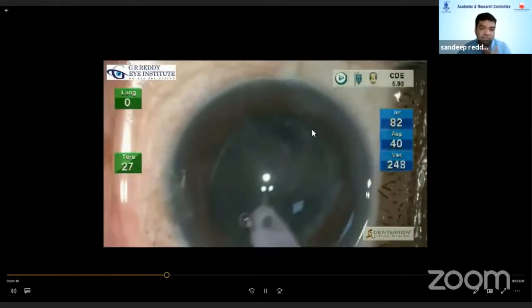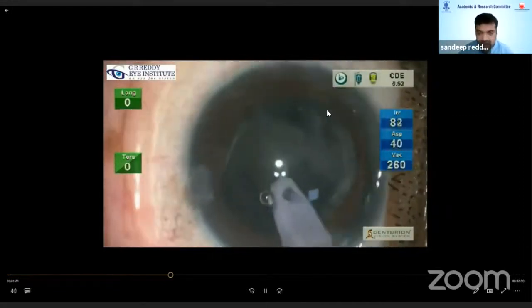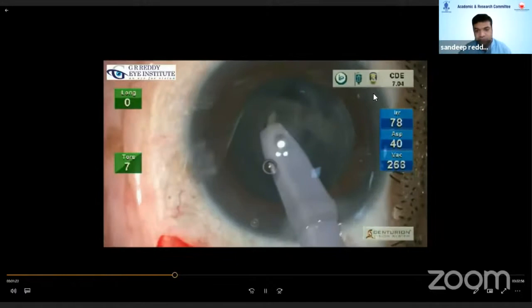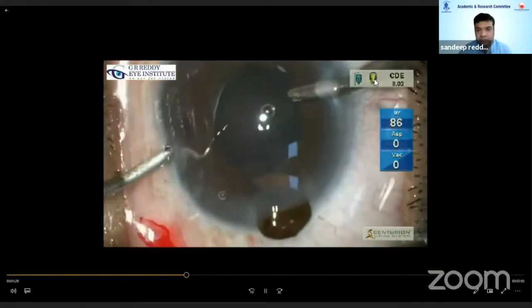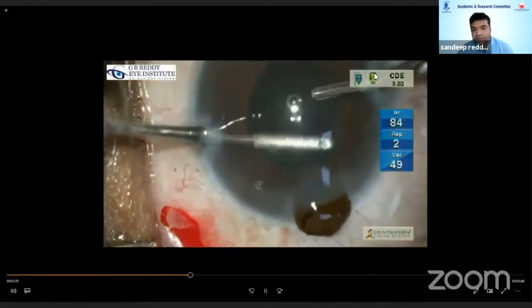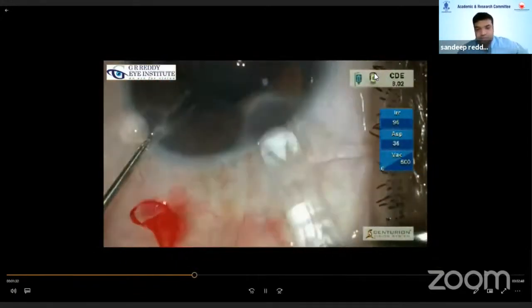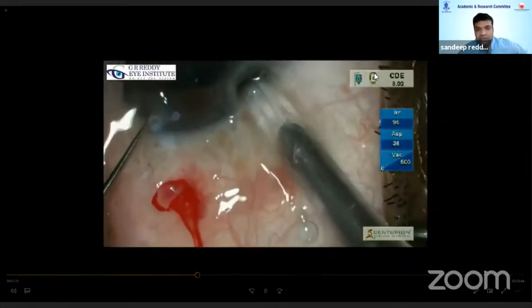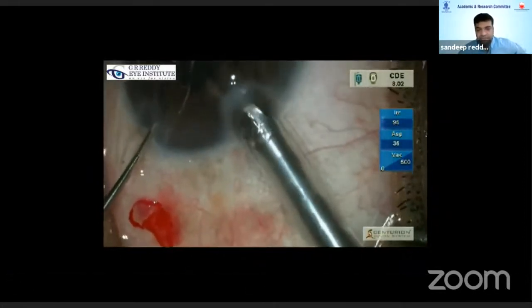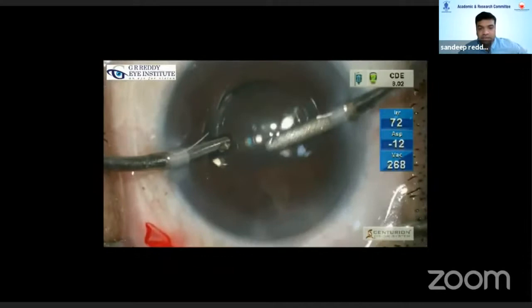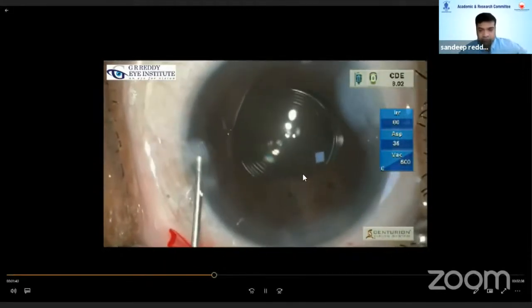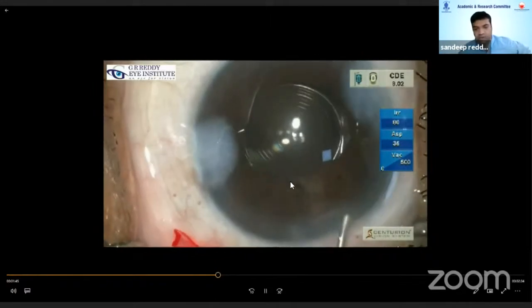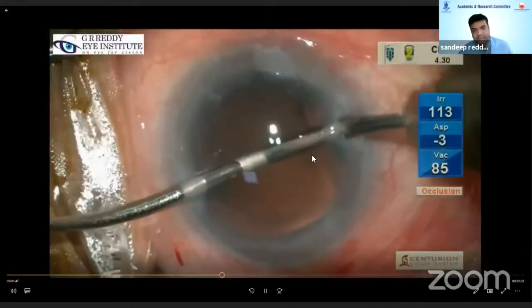In this instance, just before doing the rhexis after injecting viscoelastic, I had positive pressure. By doing a simple minimal dry vitrectomy, I could resolve it. You should not do too much vitrectomy — if you do too much, the entire vitreous will collapse and you might have a nucleus drop. Finally, I could implant a multifocal IOL at the end of the surgery. Without the dry vitrectomy, I don't think I could have completed it.